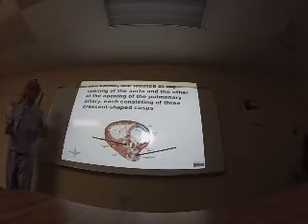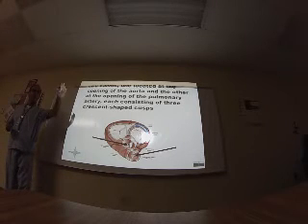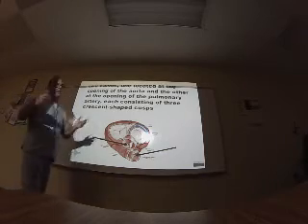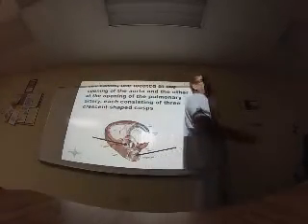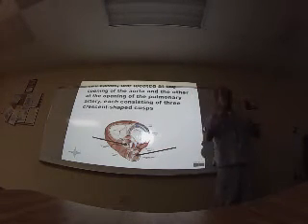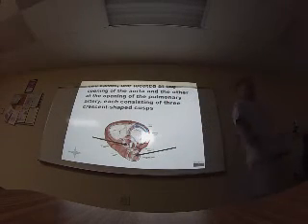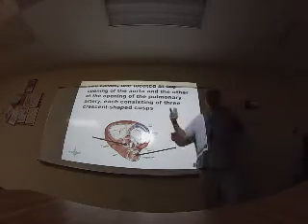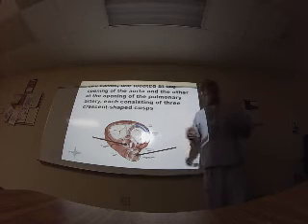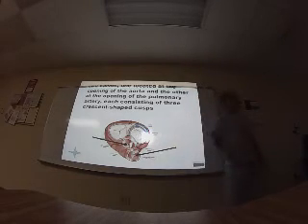Echocardiography is very good for diagnosing regurgitation, because you put color Doppler and you can see the direction of the blood that is contrary to normal. Echocardiography is very good for valves. The best of echocardiography is the valves, how the valve functions. For the electrical function of the heart, we use electrocardiography, but echo is better to see how the blood is moving.